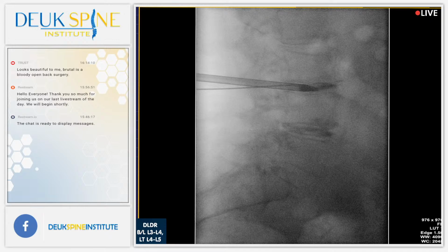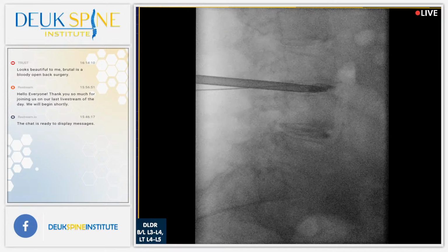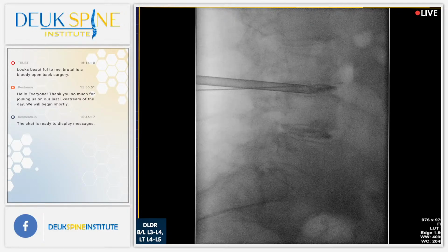We're just talking about, folks, how we can improve on our CPAP mask patient face interface. Because you've got to remember, these masks are not built for prone. They're built for supine. So when we put them prone, you've got to get it perfect. You're putting pressure on the mask. But when you're supine, there's no pressure on it because your head is on the pillow like this. But there must be some kind of prone CPAP mask that we can buy.